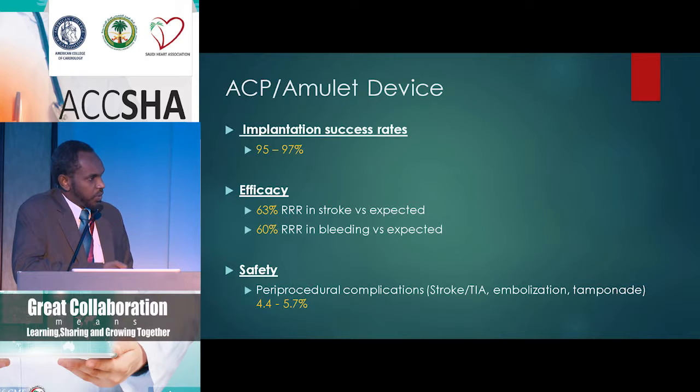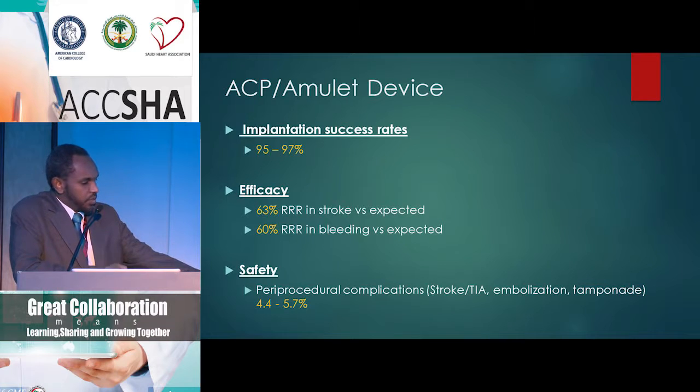Device embolization occurred about 1.5%, and same with tamponade. So I think these numbers can also be improved with operator proficiency and as the device gets more commonly used.